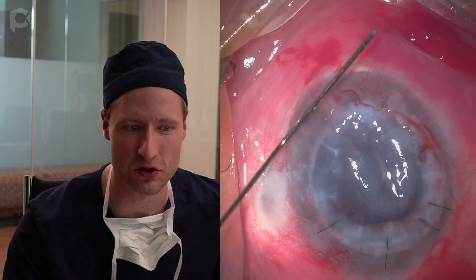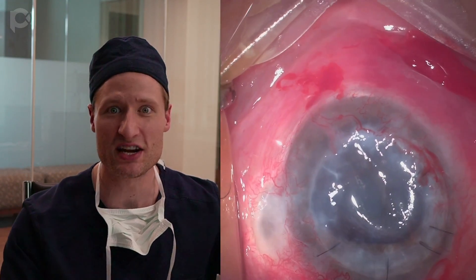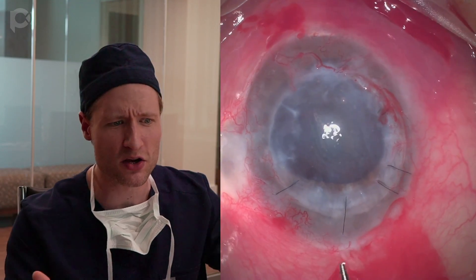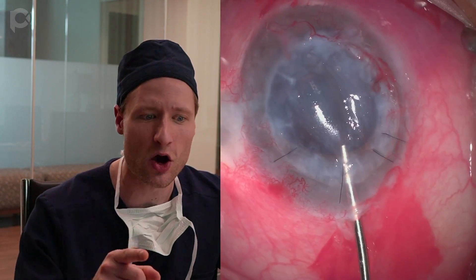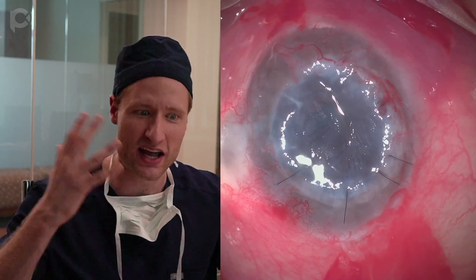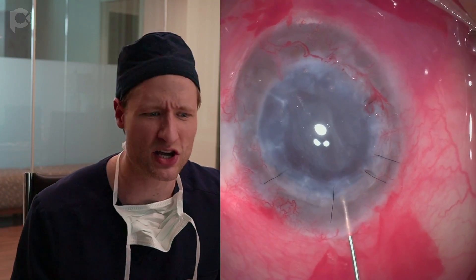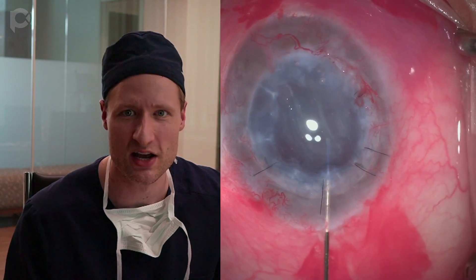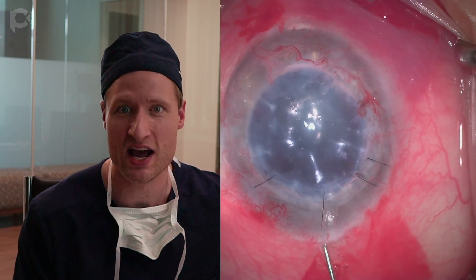This is actually the most difficult part of the operation in eyes with PKs: centering the graft. The graft is mostly centered but a little nasally decentered. Here's how you center it — using those same coaxial forceps, I reach through the wound and drag the graft over. That is so much easier than trying to bump the graft over or manipulate it with an air bubble or jets of fluid. Just grab it and pull it over. There's no way that is more injurious to cells than knocking against them with an air bubble for five or ten minutes.